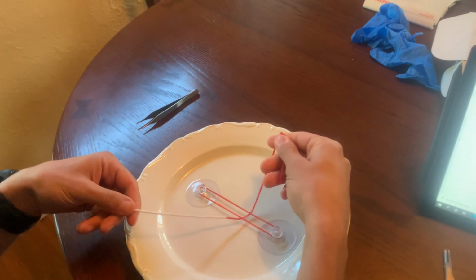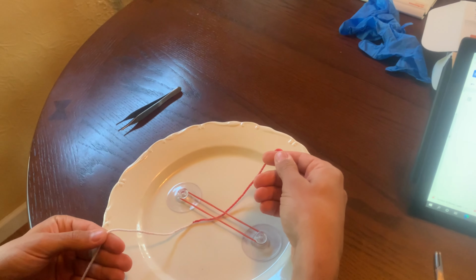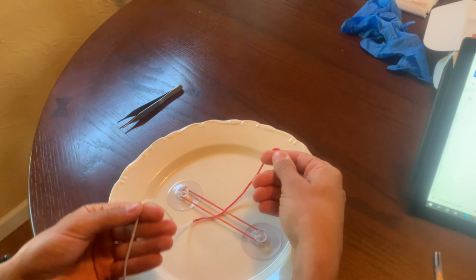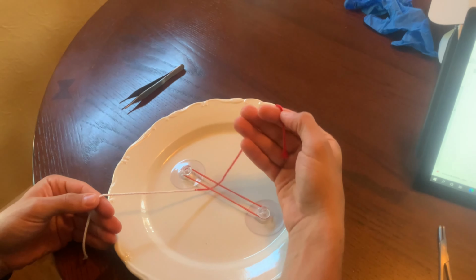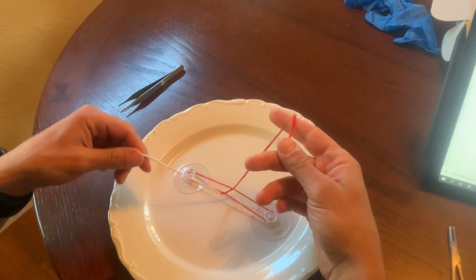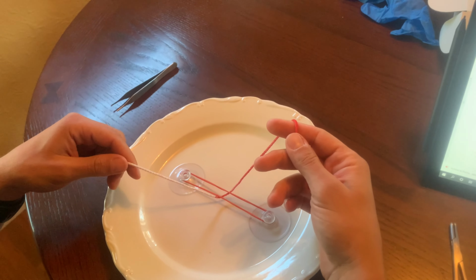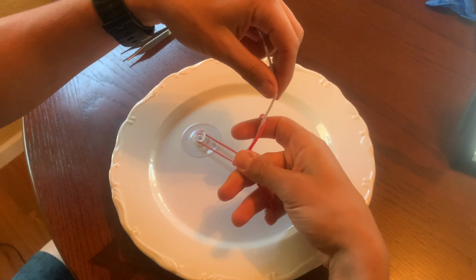All right, now get positioned to make sure the long end of the suture is held inferiorly with your left hand, and the short end of the suture is held superiorly in your right hand. To begin the knot, start by creating a locking knot at the base to maintain tension. There are two types of knots you can begin with. Tyler's going to do a double throw, but you can also do a single throw.